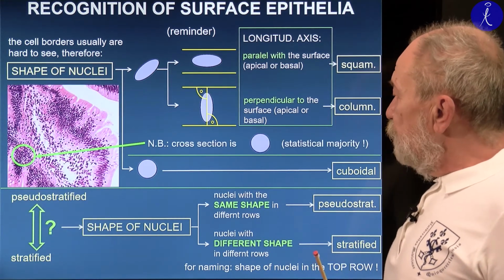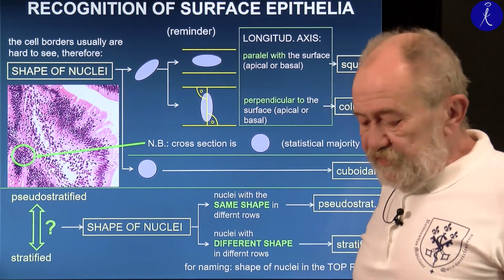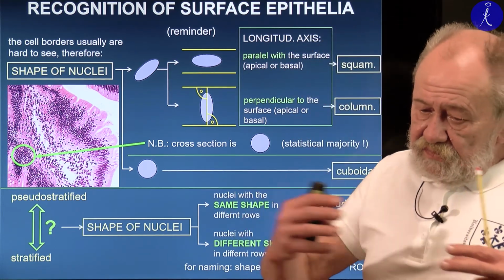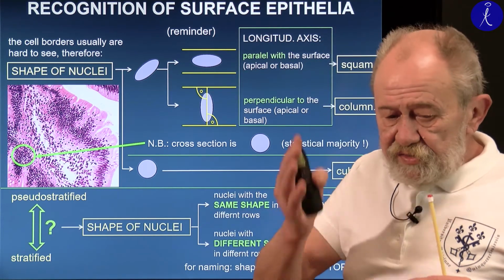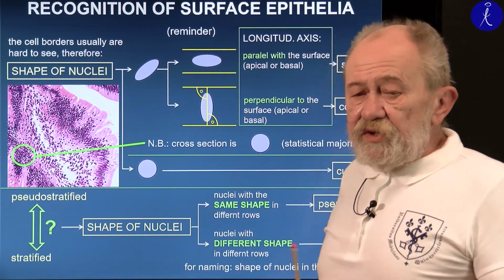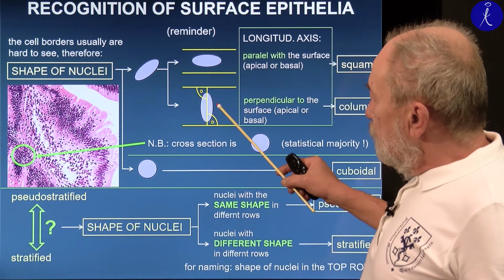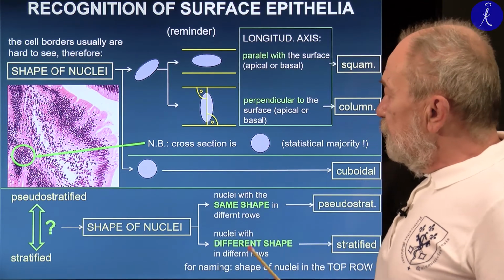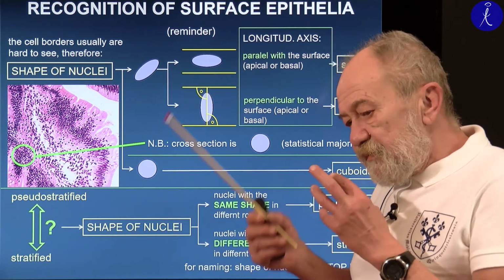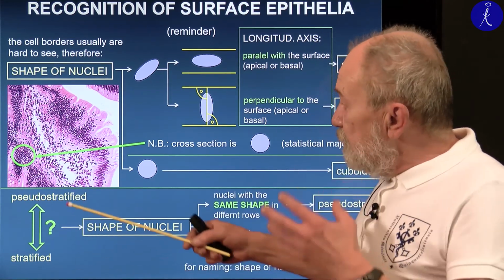The only problem with this round nucleus that everyone knows by cutting an egg perpendicular to the long axis of the egg, all the cuts appear round, so the oval could be cut into round if cross-sectioned. So in this case, a statistical measurement should be done in your mind.